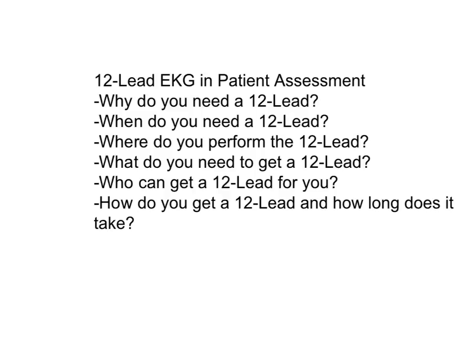But you should have a real low threshold for doing a 12-lead. If you think you might possibly need one, if you think there's any chance there's cardiac ischemia involved, get a 12-lead. It's fairly simple. So when do you need one? Quite often. And repeat ones. Every time you run another set of vitals, another blood pressure, run the EKG real quick.